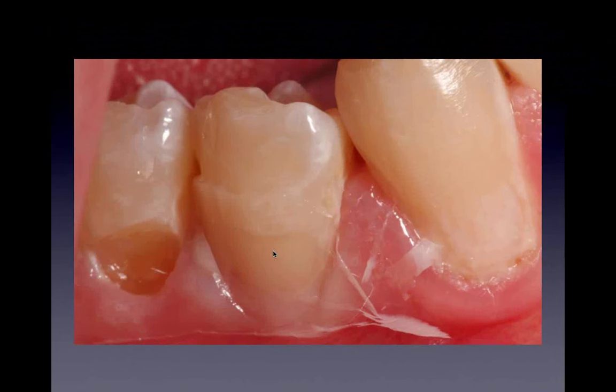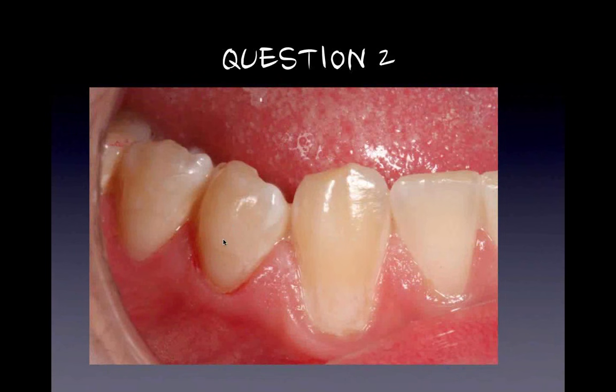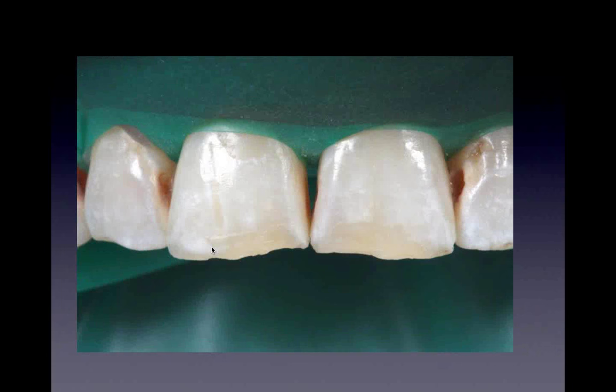And here's the other side. We do one at a time. Same thing with the other one. That's really a great technique to use, those cervical matrices, just to get rid of that decay. Here's your question number two. It's coming up now, and then we'll go ahead to the anteriors. We'll isolate it. You should be seeing a poll on your screen. What did we use to get compression on the caries on the cervical areas? Please enter your answer.